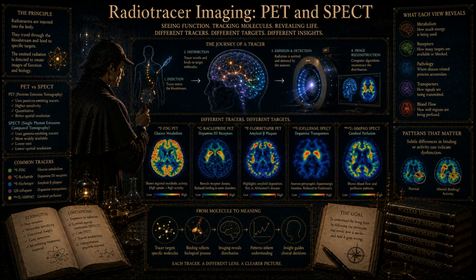It explains why carbon-11 research is almost exclusively the domain of massive, well-funded academic medical centers. But there is a silver lining to that rapid decay, isn't there? There is, actually. Because the radioactivity clears from the patient's system so rapidly, you can conduct multiple scans on the same individual in a single afternoon. You could scan them at baseline, administer an experimental therapy, wait an hour for the radiation to clear, and then inject them again to scan the altered state. It is invaluable for dynamic research.